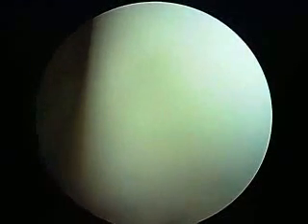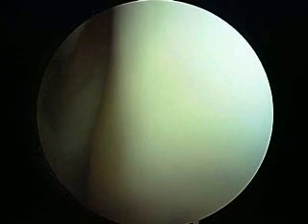Now we're coming around. This is the middle 1/3 of the meniscus. This is the anterior 1/3 right here. And all of that looks pretty darn good. This is your articular cartilage of the top of your tibia, the lateral tibial plateau. See how bouncy it is? That's good. That's normal. That's a young man's knee. There's no arthritis in there.